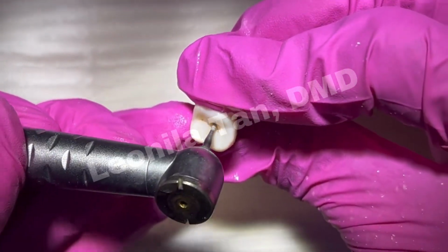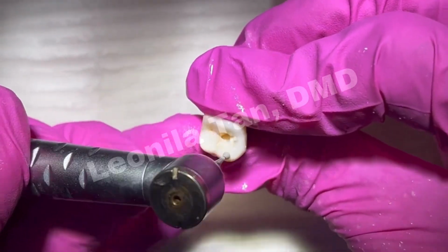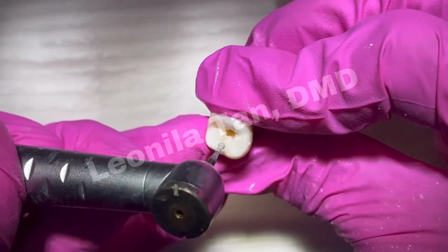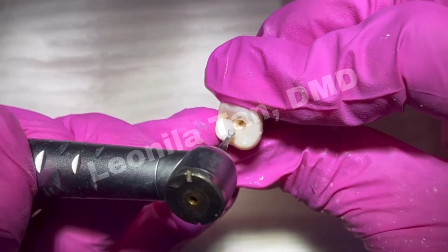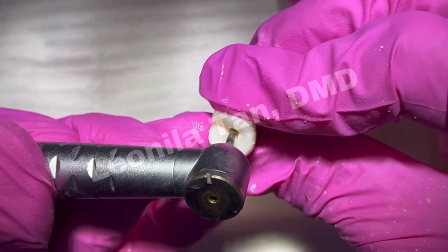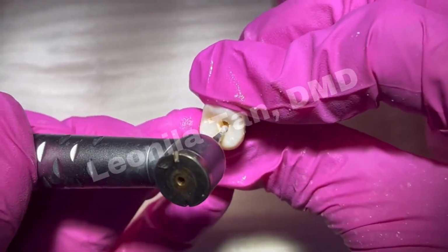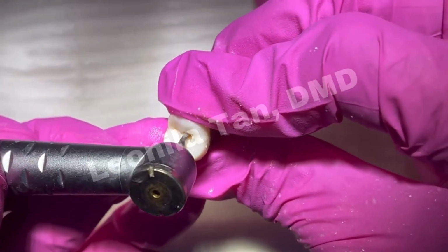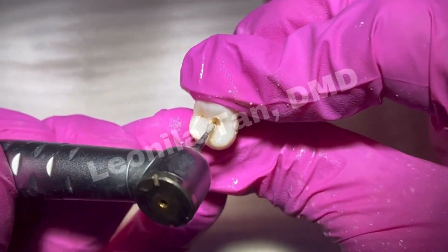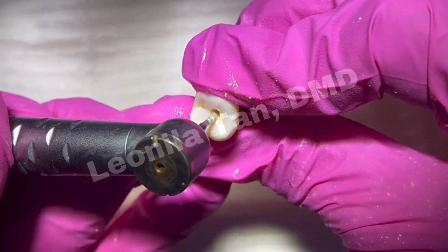So always feel the catch, out to the catch. You're just following. You don't really know the shape or size of your chamber, and you're always safe when you follow your round burr. Never use the fissure burrs at this point.